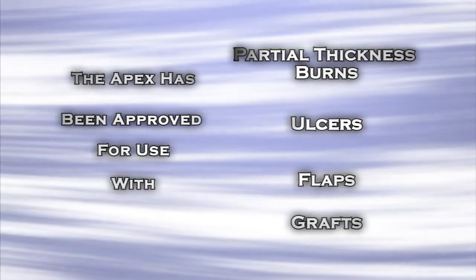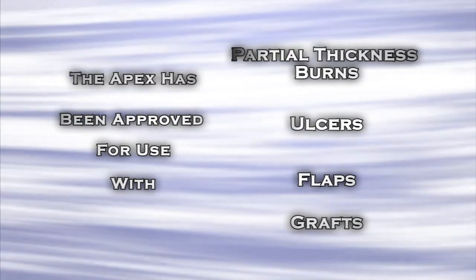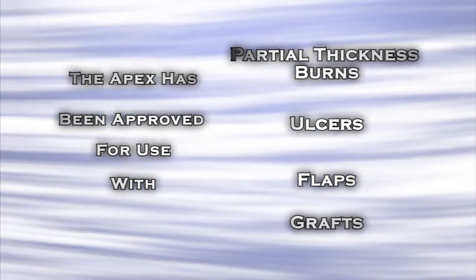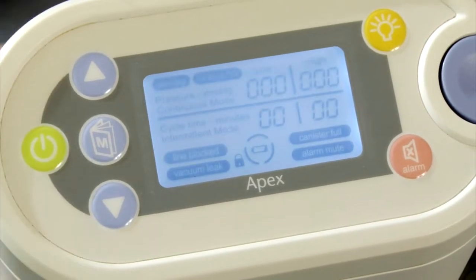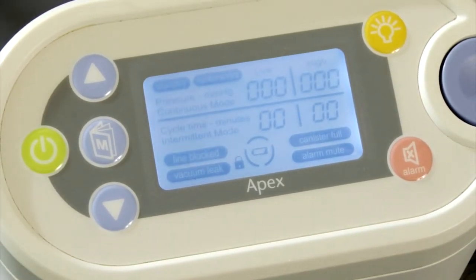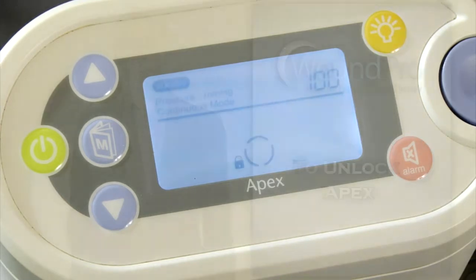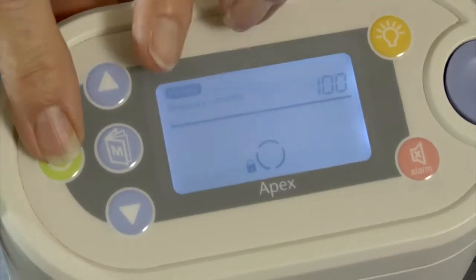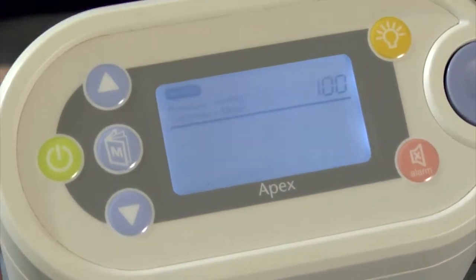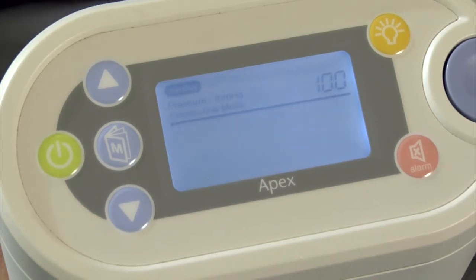Unlike many negative pressure wound therapy pumps, the feature-rich Apex is simple to operate. Let's get right to it. To turn on Apex, you simply hold down the power button until the screen illuminates, and after several seconds it will display the software revision number. To unlock Apex, press the menu button while holding down the power button. Then release both. You will see the currently selected therapy flashing on the display.